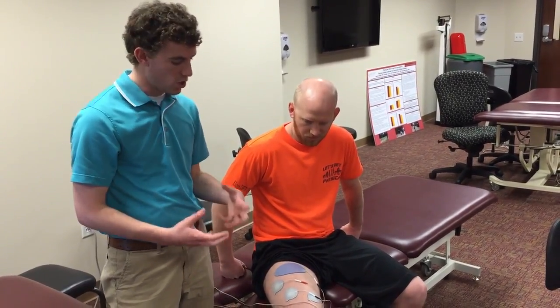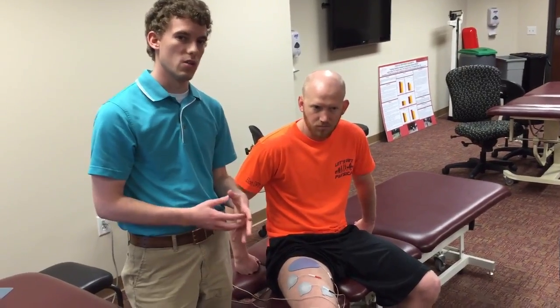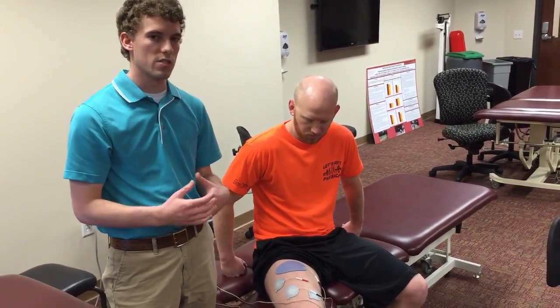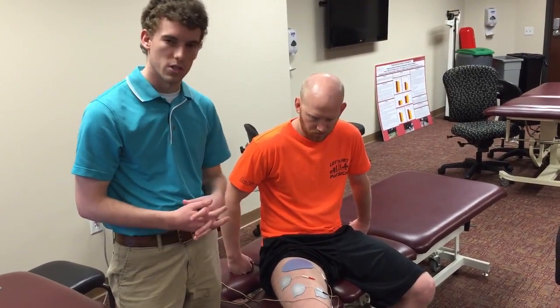The patient was instructed to contract the quad at the same time that the electrical current was going into the quad, to increase volitional contraction as well as stimulate the electrical contraction.